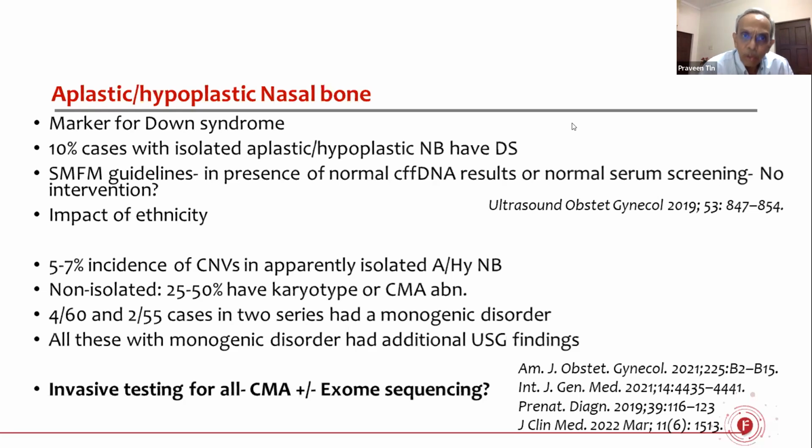Whenever you have a hypoplastic nasal bone or an absent nasal bone, those are fetuses that have to be evaluated or investigated further before you label them as isolated and insignificant or a simple dysmorphism of the face. Yes. So we should at least be doing a microarray for all these cases. But whether we should do exome or not, I don't think we have enough data as of now.